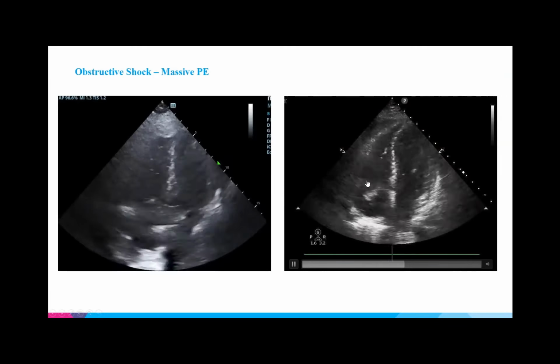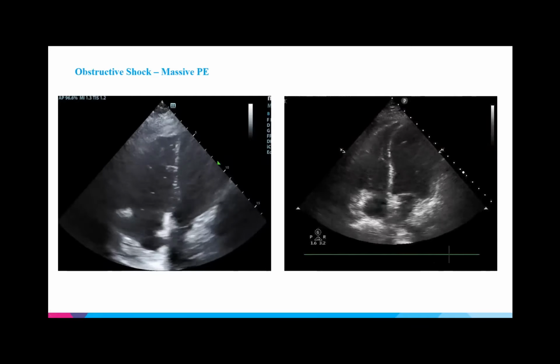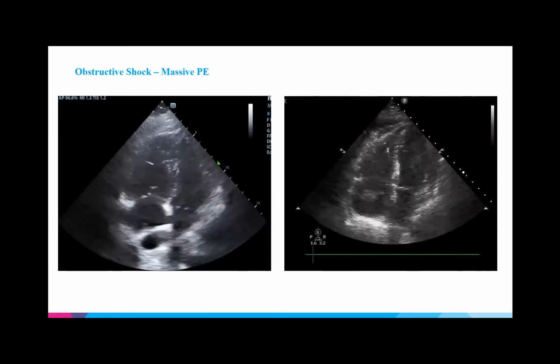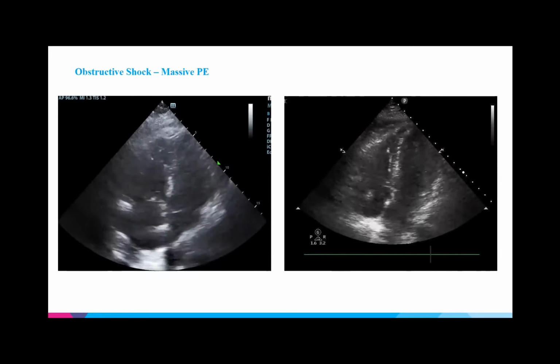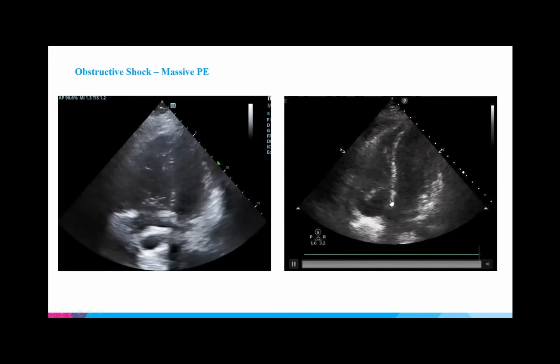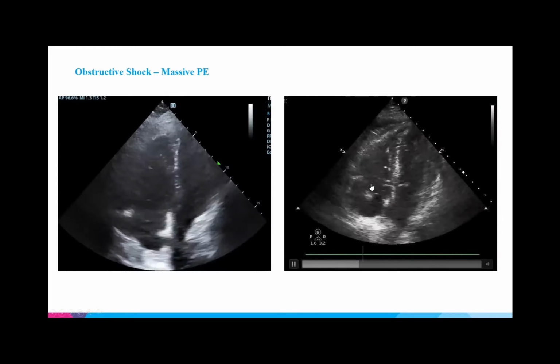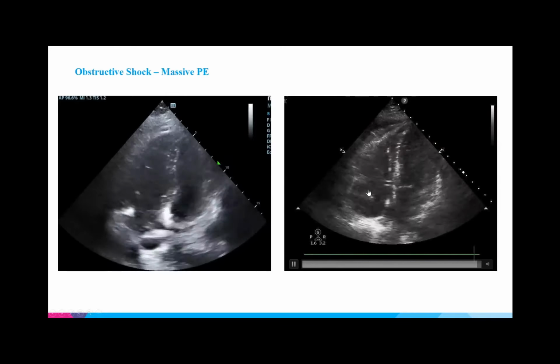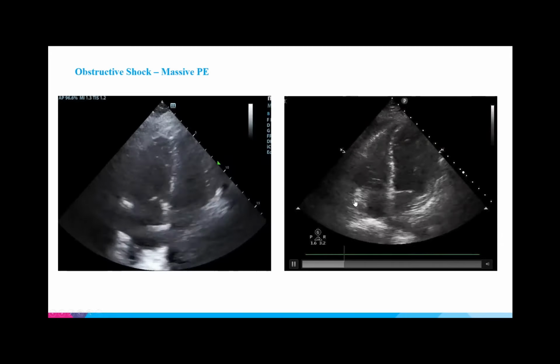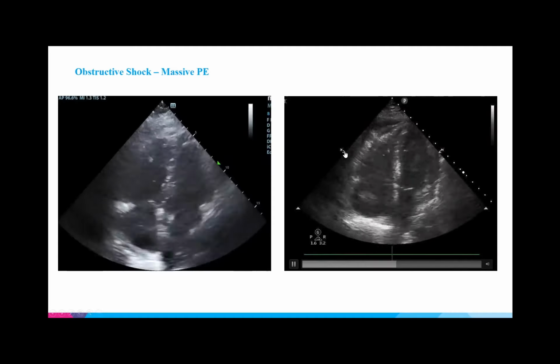But this is a clot that is impending, moving towards the pulmonary artery, right? So that would be very bad if the patient already had significant clot burden in the pulmonary arteries. If this were to go and occlude further, that might be an emergency. So this would be a patient that would definitely need a PERT activation and potentially clot retrieval. But yeah, this would be a dreaded, scary complication that you might see. Very, very unusual, but we do see it maybe a couple times a year.